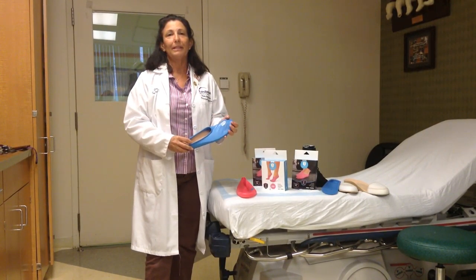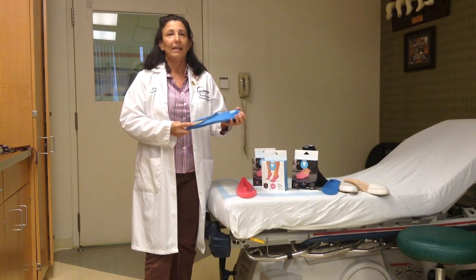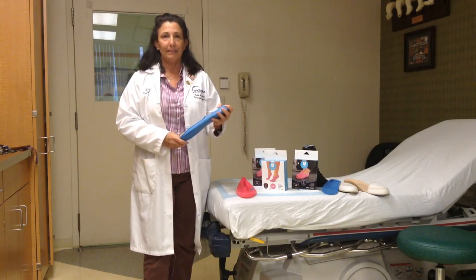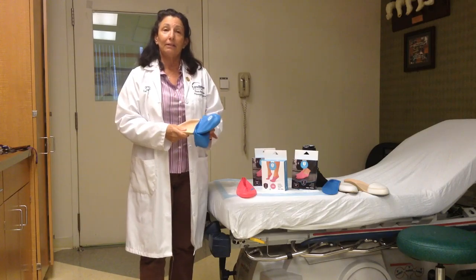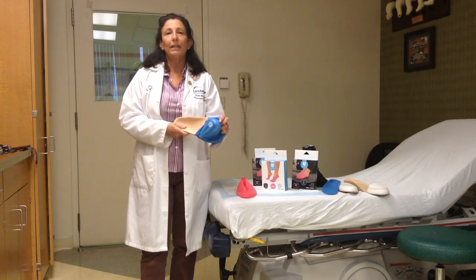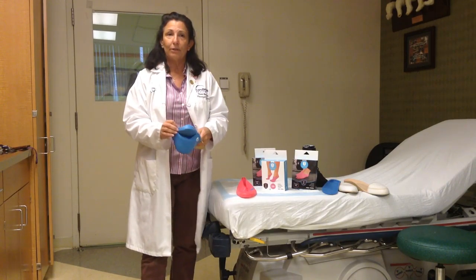Hi, I'm Terri Salpert, orthotist and certified pedorthist, here to talk to you about jelly feet. Today I want to talk about how I can use the jelly feet, the foot covering, as an overlay on a toe filler for an amputation.